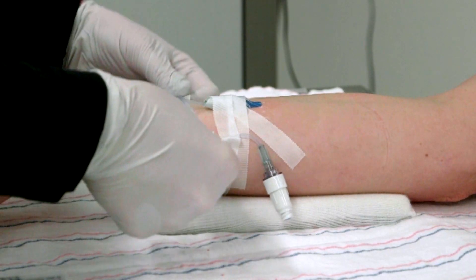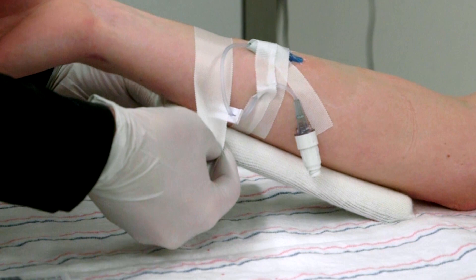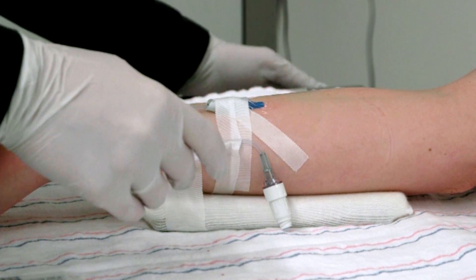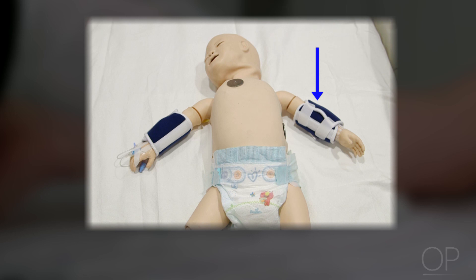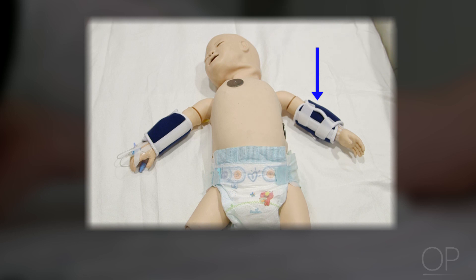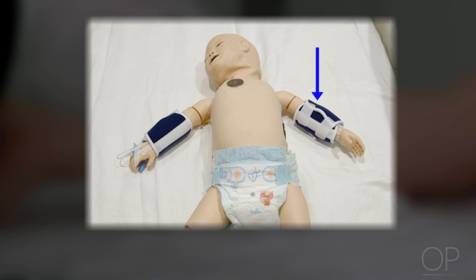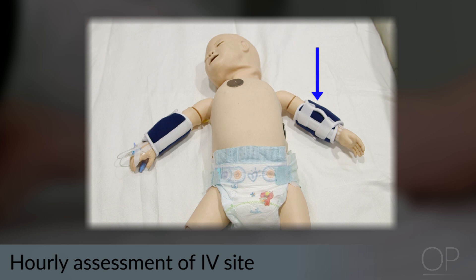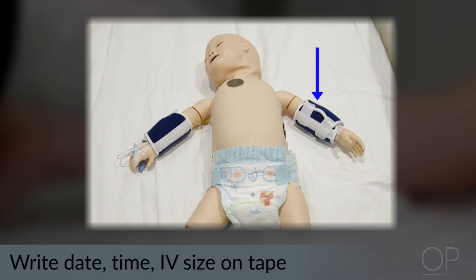When an IV is placed over a joint, use a supporting device such as an armboard to keep the child from bending the extremity. A protective device can also be placed over the IV to avoid accidental removal, such as a sock or a wrap. The protective device should be removable to allow for hourly assessment for signs and symptoms of infiltration or phlebitis. Finally, put the date, time, and size of the catheter on a piece of tape across the dressing.